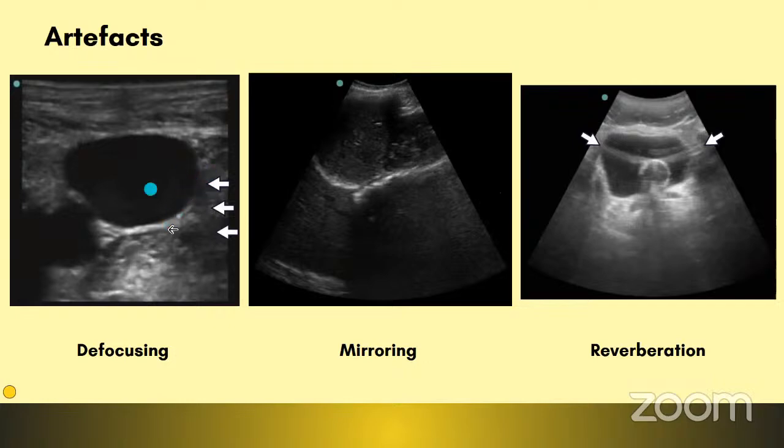However, if you see the posterior or deeper aspect, it is much brighter, as I told before, which is posterior acoustic enhancement. This part is called lateral cystic shadowing, because the ultrasound pulses, which should come from above to below, are just getting splayed because of the curved nature. So it mostly acts like, how to say, a convex lens for sound waves.